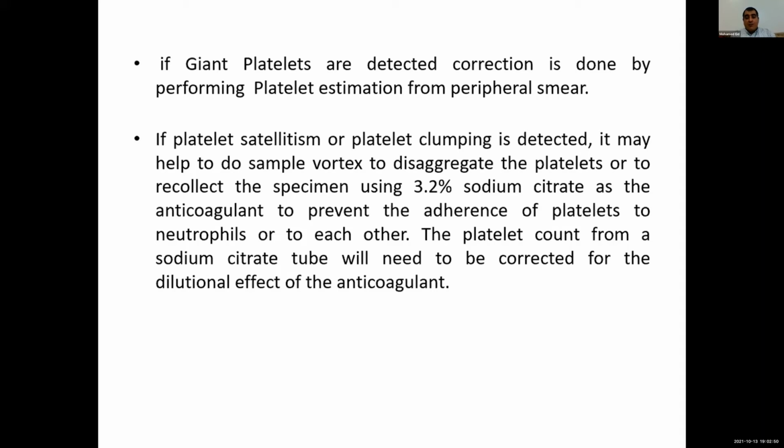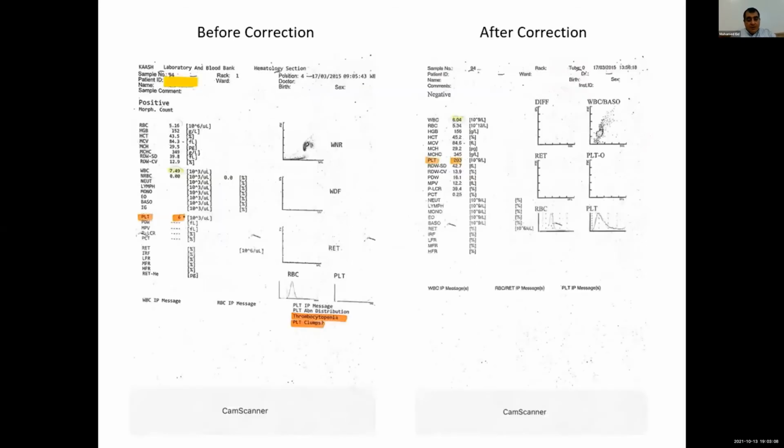But if we use sodium citrate, the platelet count should be corrected for the dilution effect of the anticoagulant used.